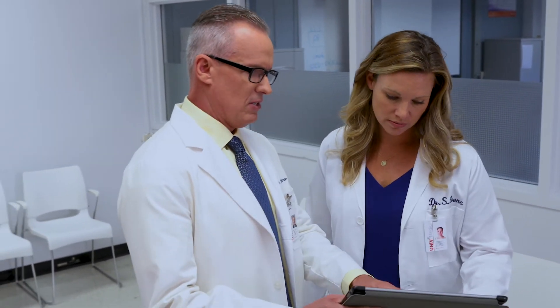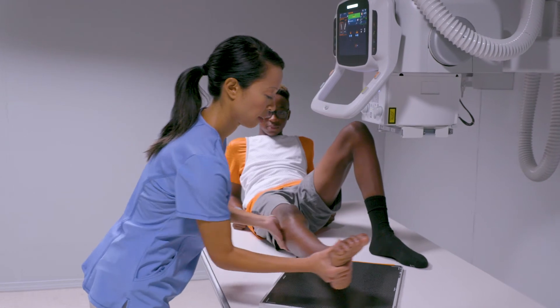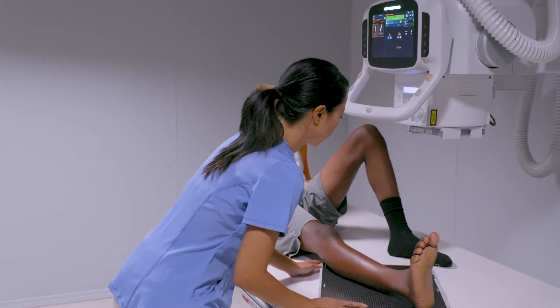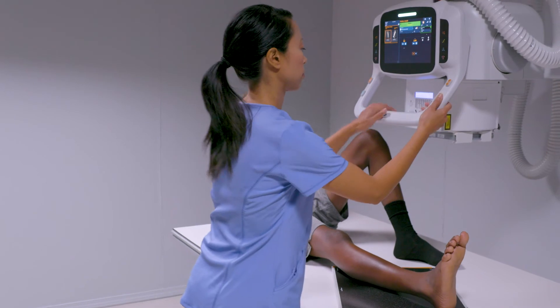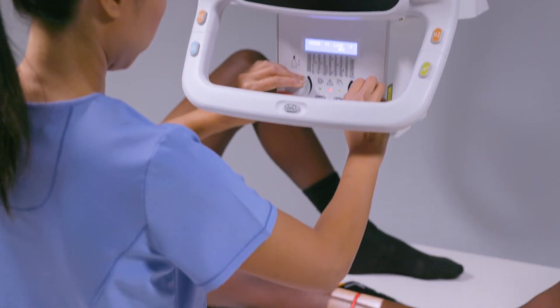CareStream's smart grid gives us a virtual grid that improves contrast and reduces the appearance of scatter radiation in an image, and that reduces the overall dose to our patients. Special pediatric software also sets the appropriate acquisition protocols across a wide range of sizes, from the smallest neonatal patient to our largest adolescent. This allows us to make sure the correct technique is being used and delivers consistent imaging even among our most dose-sensitive patients. Along with the CareStream cesium detectors, this gives me the confidence that patients are getting the best possible images at the lowest possible dose.